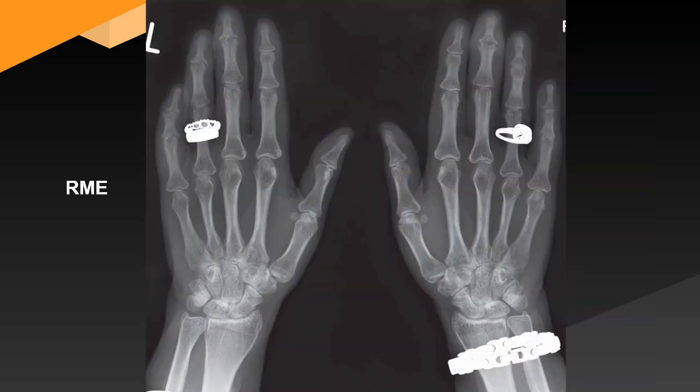These are dorsopalmar views of both hands. There is asymmetrical erosive polyarthritis involving the whole of the articular surfaces and affecting both right and left middle, ring and little fingers distal interphalangeal (DIP) joints, and also the left little finger proximal interphalangeal (PIP) joint. The right little finger PIP joint appears ankylosed.